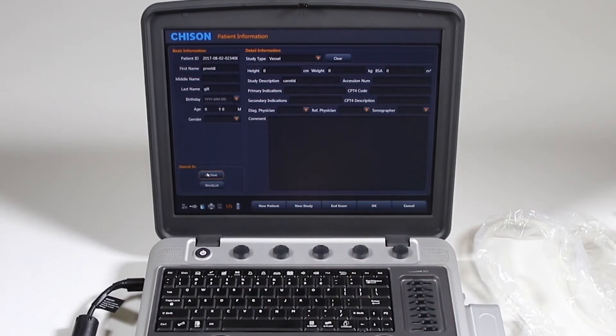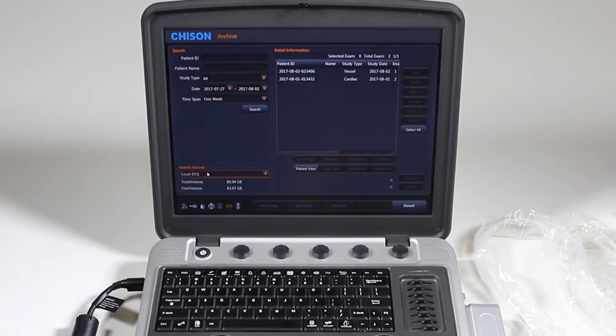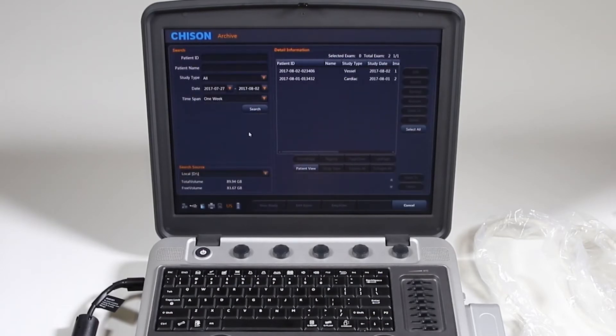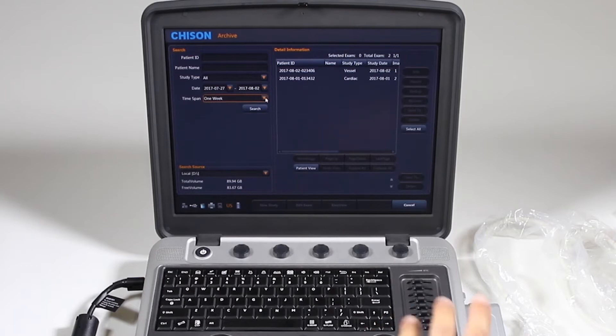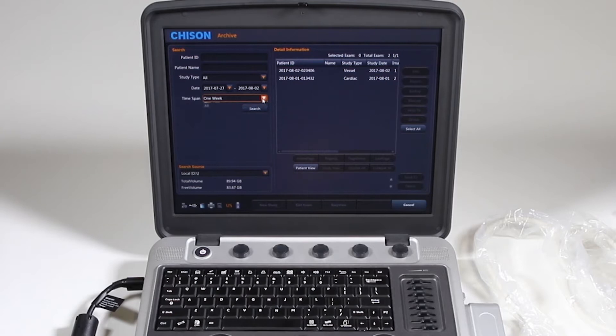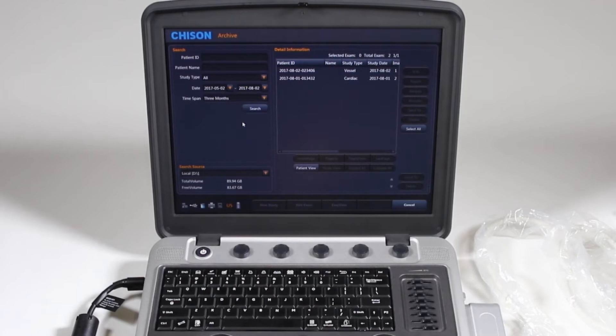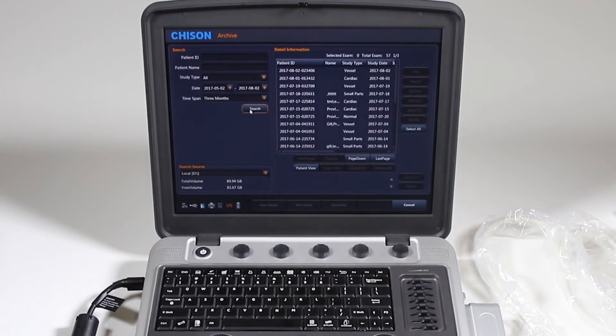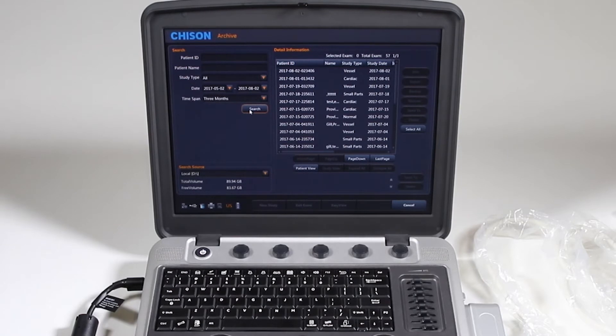We can also go back to the archive and look for previous patients. And yours may default to a time span of one week. So if you have a previous patient for more than that, it'll just look like you have two patients here. So what you really want to do is maybe go to all one year, things you've done in the last six months or three months. So as you can see, if I hit three months, it's going to show me all the exams I've done in the last three months and it'd be easier to find your patient that way.